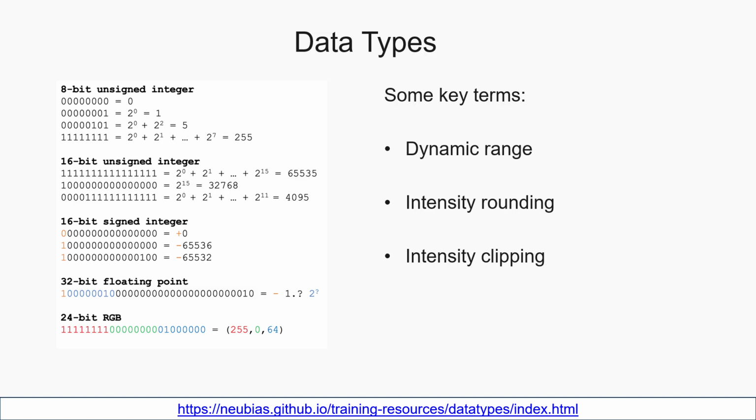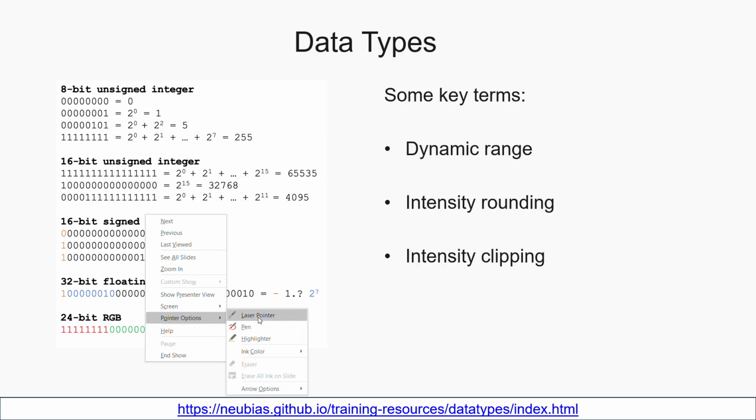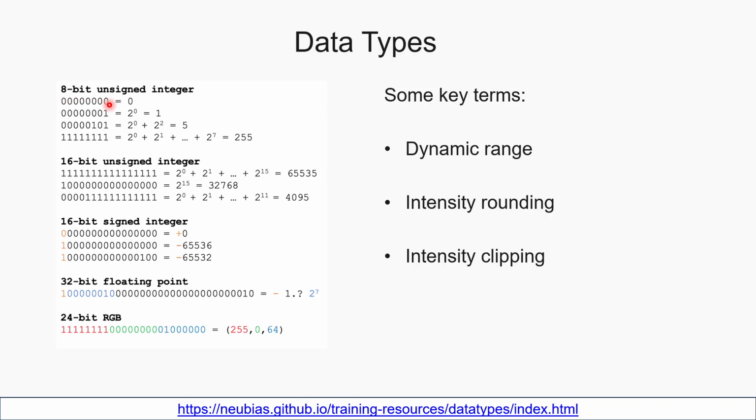A bit depth refers to a binary number and the number of zeros or ones that form that binary number. Each of those numbers are coefficients to 2 to the power of the relevant index. For example, in the top we have 0 represented by all zeros, meaning that every coefficient in front of a 2 to the power is 0 and so sums to 0.